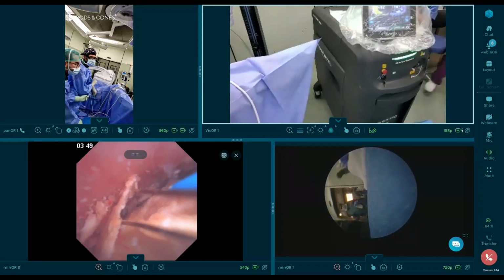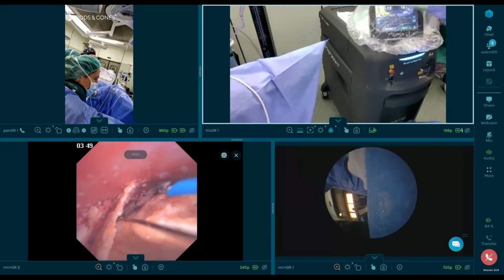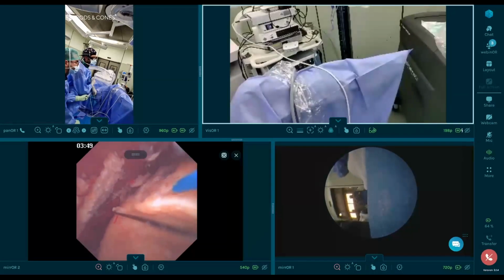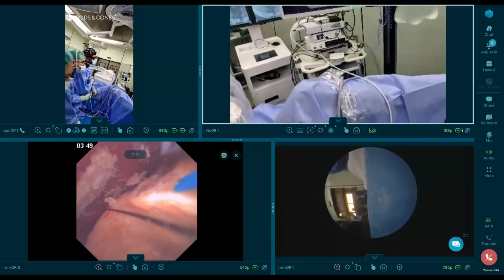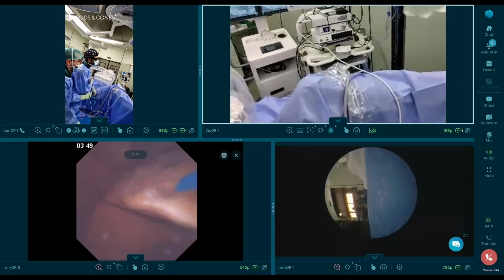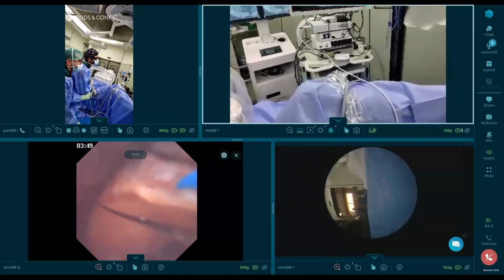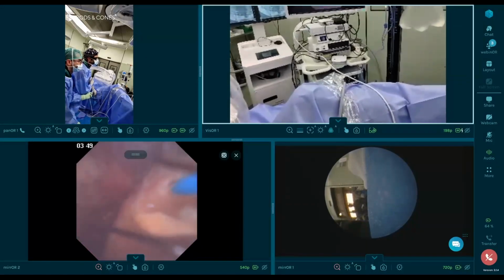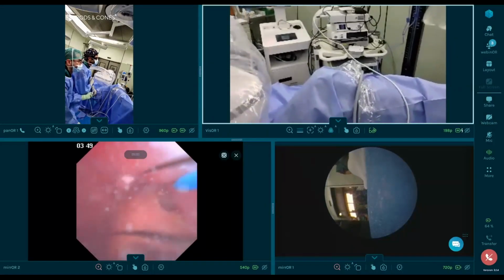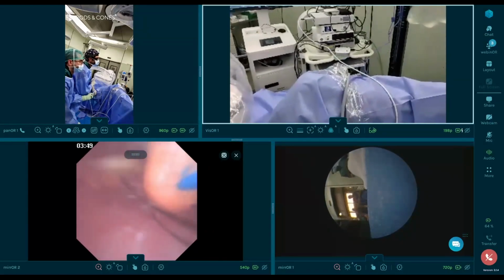Sube la energía a 0.8, por favor. Eso. Okay, so 16. You see? 0.8, 20 hertz, and 16 watts. So less than 20. It's a little bit better now. Less than 20 for the kidney, and even less than 10 for the ureter, to be on the safe side.